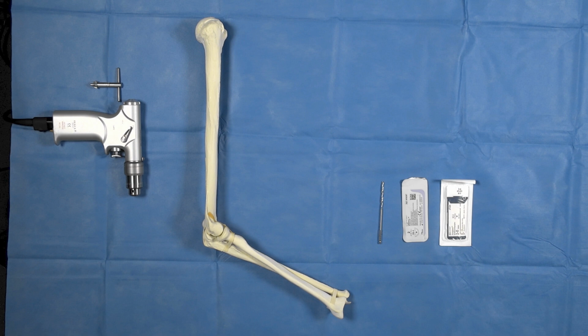The indications for lateral ligament reconstruction are situations where the patient has a painful subluxation of the radial head, typically associated with a condition called posterolateral rotatory instability of the elbow. That's where there's a deficient lateral ligament complex, often extending into the common extensor origin.